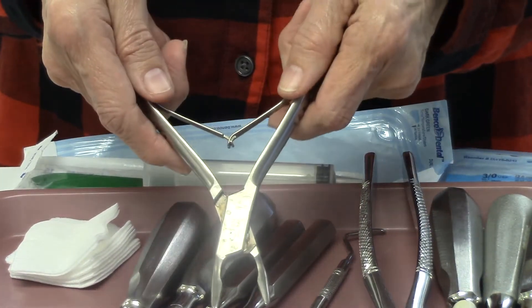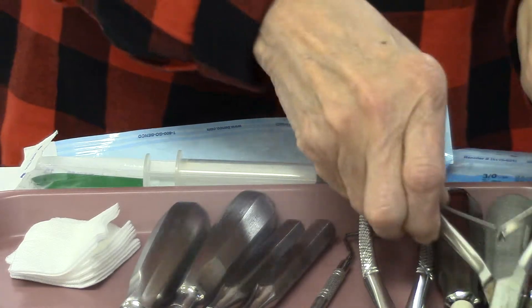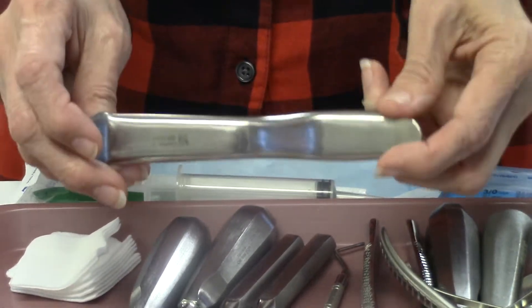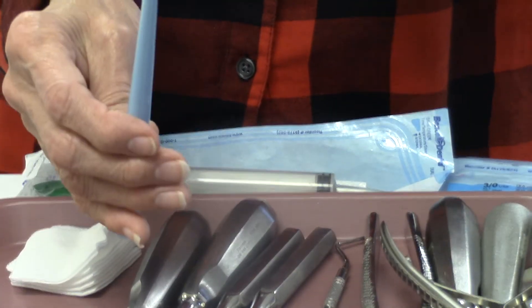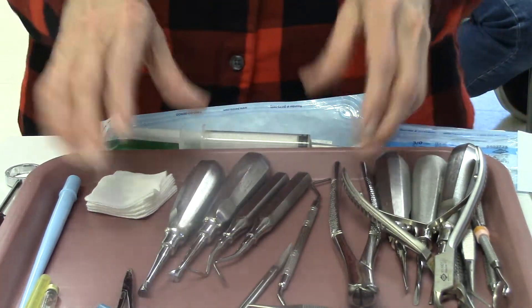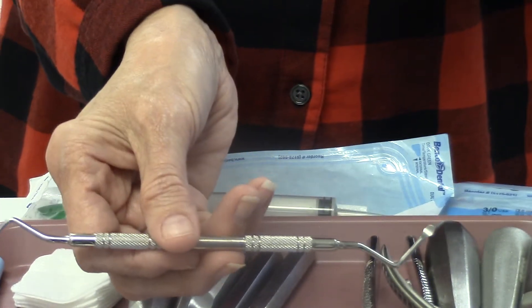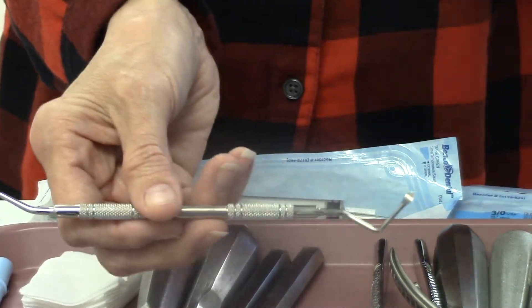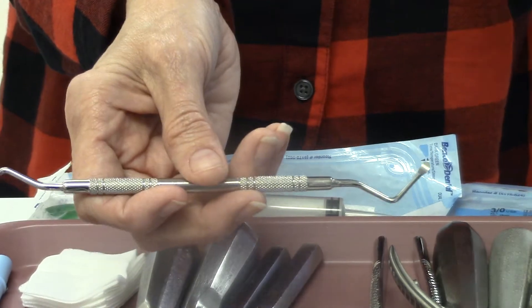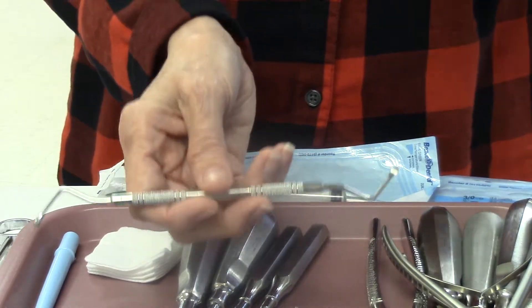We put the rongeur on. The reason we use the rongeur is in case we have to remove any tissue. We have our Minnesota retractor for retraction, our surgical suction tip, and our gauze. Now, the thing that varies on this surgical tray is our surgical curette. This curette looks like a spoon but much bigger — it goes down into the socket and removes any dead tissue, and can also be used to stimulate blood flow.